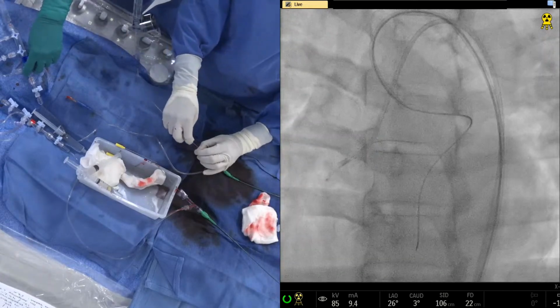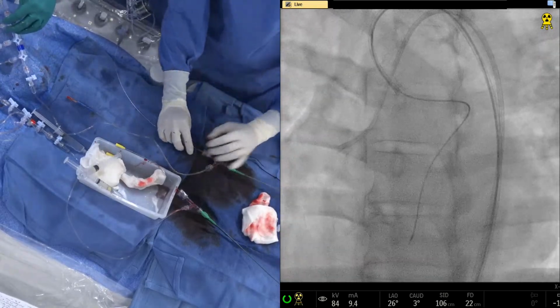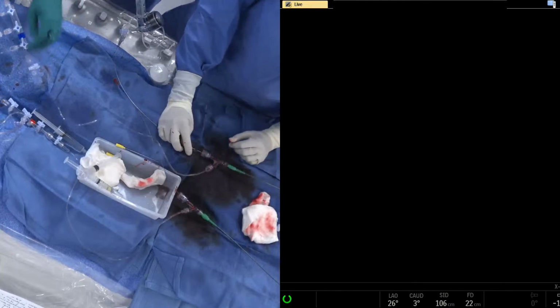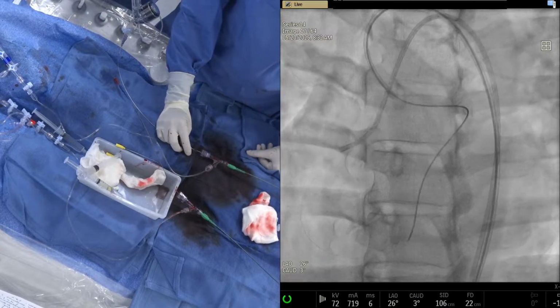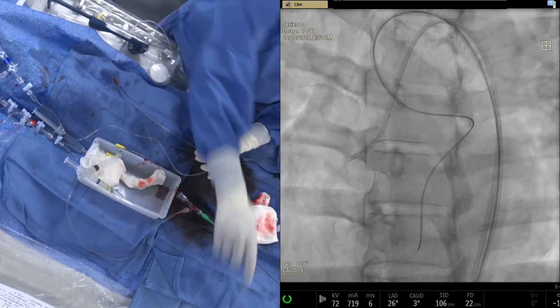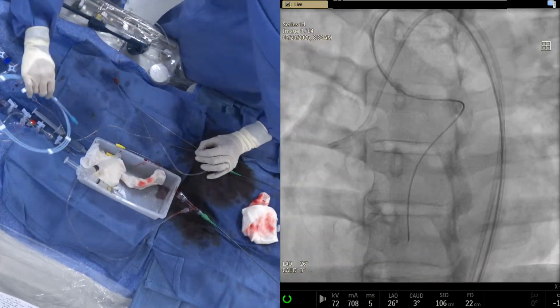Okay, I think come back in the guide and see. Okay, some dye. Let's take a scene. Antigrade, right? Okay, good. Yep, that's fine. Give me the antigrade run through, we'll dilate. I think we'll leave this alone. Yeah, there is a tight lesion there.